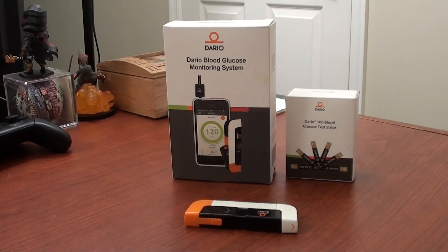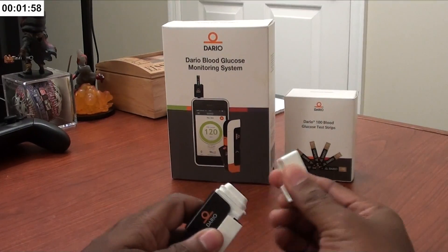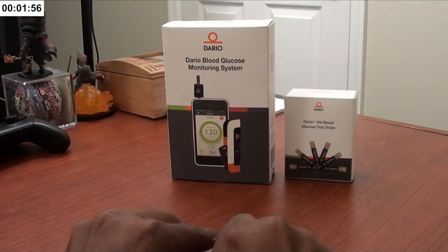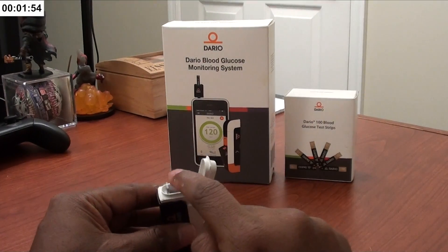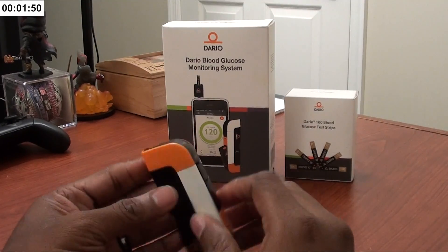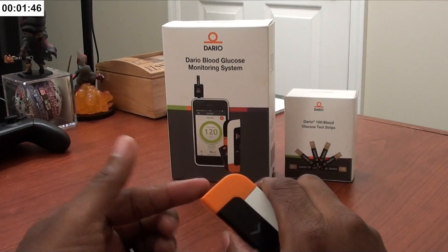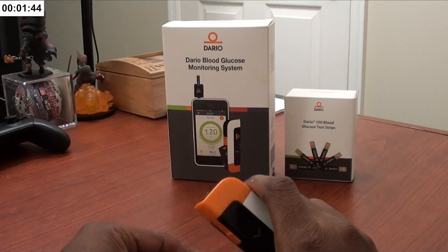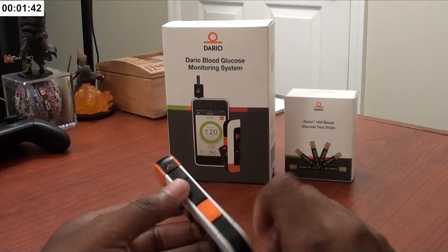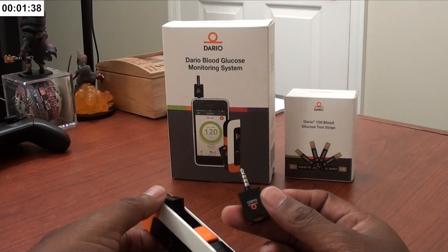So let's start. This is your kit — it holds your test strips, can hold about 25 test strips in here. Your lancet is in here — prime it, put it down, put your finger in there, push the button, and you get a little prick.